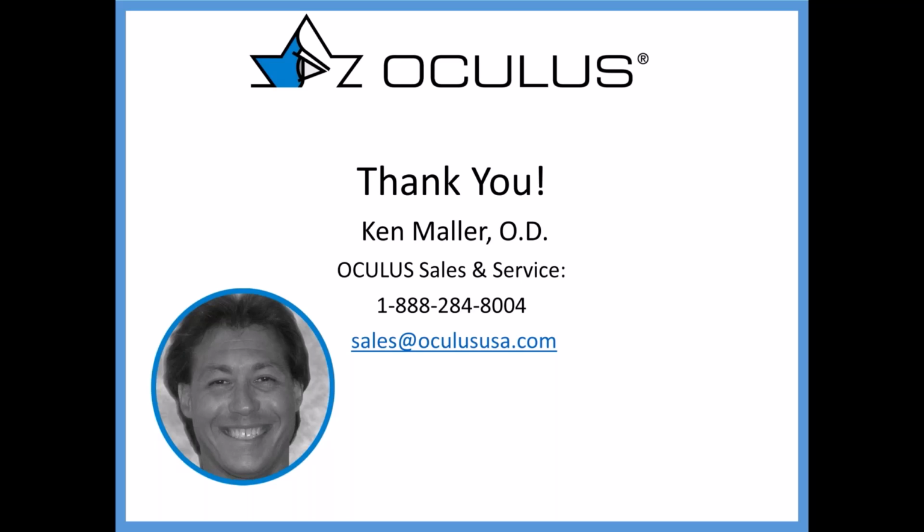Sure, absolutely. Well, first, let me go on the record here that I never, ever, ever dispense a default lens. So I believe in bringing my knowledge base to the table when I'm designing a lens, and I will typically bring the experience that I've accumulated over nearly a quarter of a century working with Wave and these asymmetric lenses, so that I can get a lens that's going to be as close to perfect as possible in the first shot out. As far as edge, for scleral lenses, edge and limbal clearances and angles, I really rely very, very heavily on trying to get the lens into what I would refer to as accepted normative ranges based on historical data that's been collected on scleral shape, as well as what I measure on the patient's eye directly.